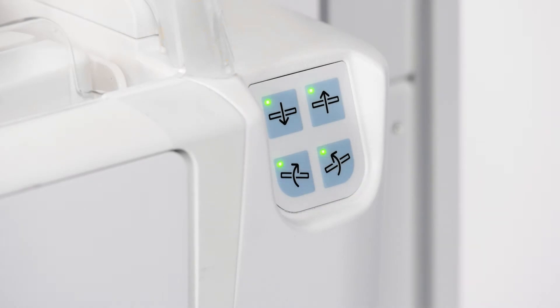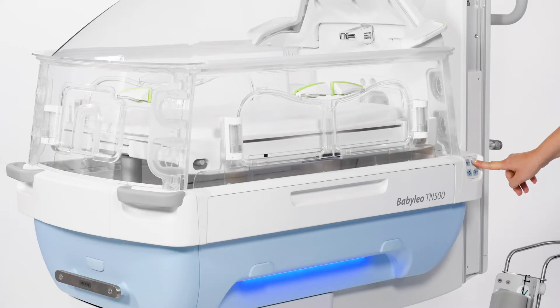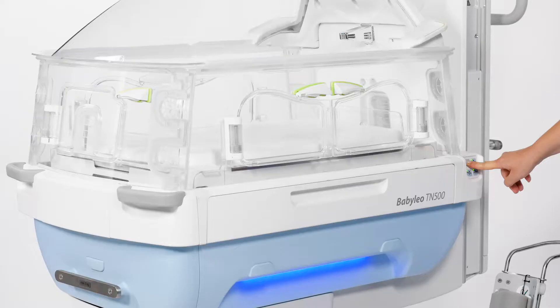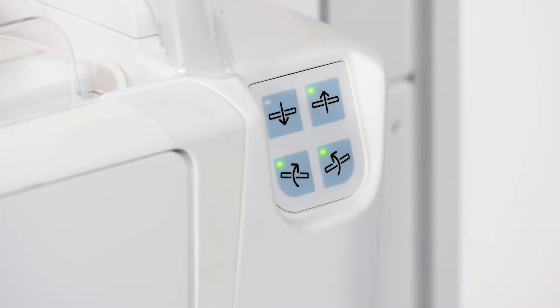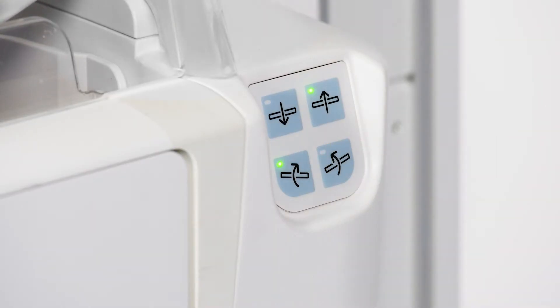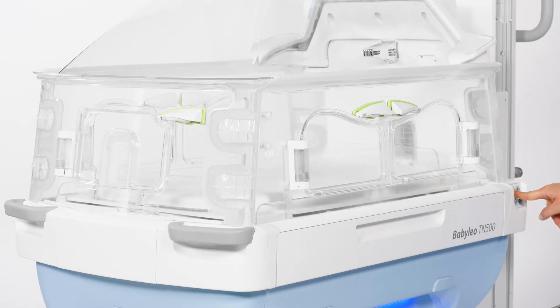To adjust the mattress for height and tilt, use the buttons on the mattress tray control panel. There are two buttons to raise and lower the mattress, and two for tilting it. Pushing this button raises the mattress tray, while pushing this button lowers the mattress tray. These two buttons tilt the mattress according to the direction of the arrow. The mattress tilt will stop when the bed is in even position. Notice that the LED in the buttons will go out when maximum height or tilt is reached. This can be done from both sides of Baby Leo.